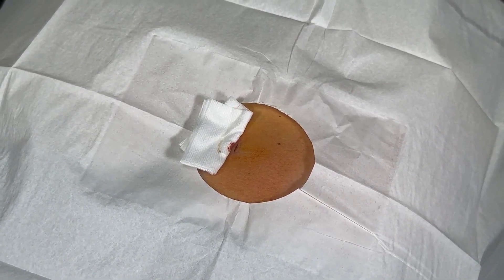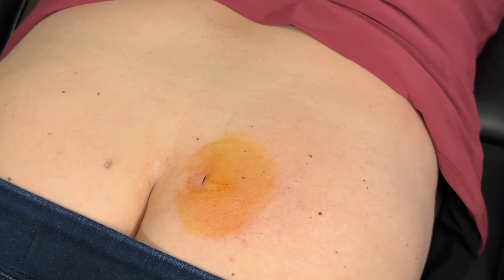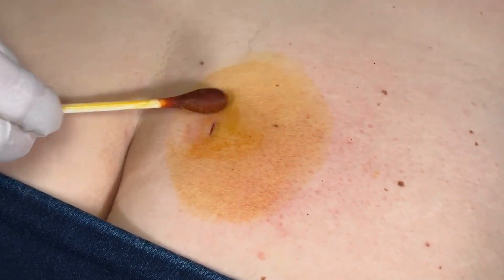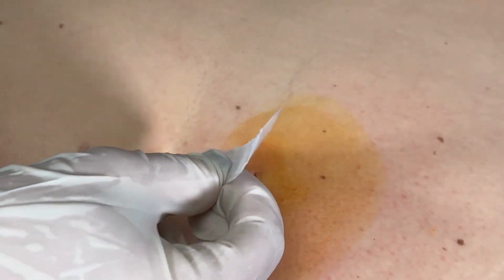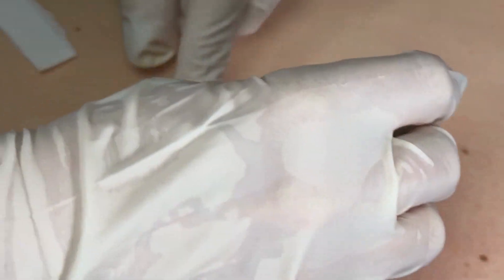And then we just close up. You want to try to keep the steri-strip on for at least three to five days so that incision will close up nicely.